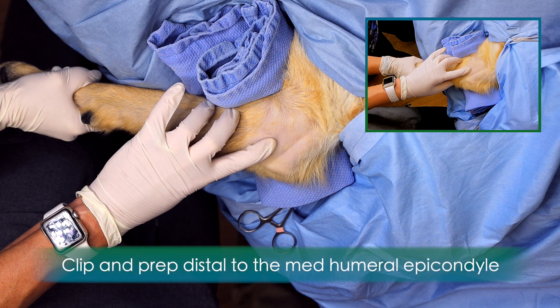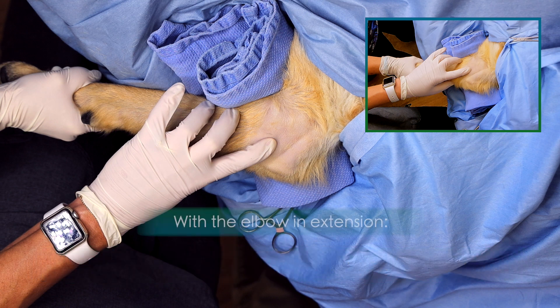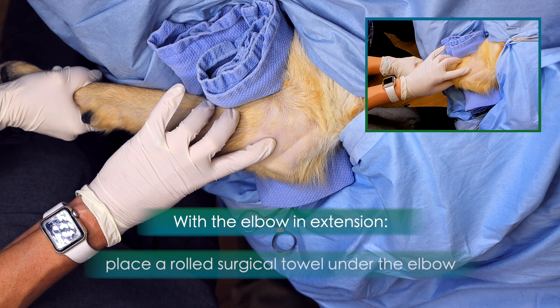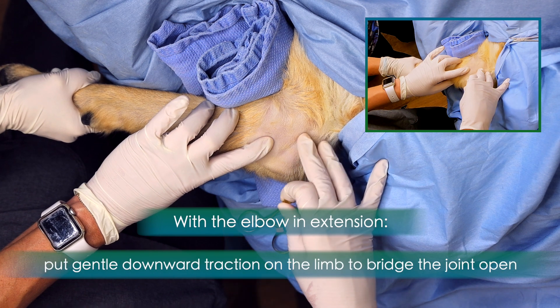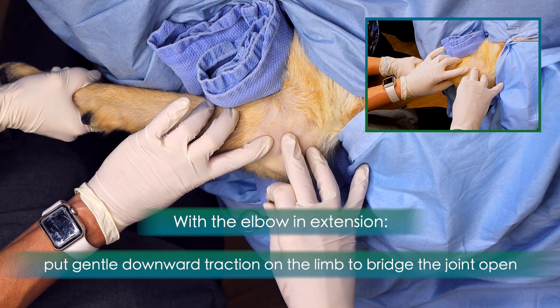The joint should be clipped and aseptically prepared for injection, distal and caudal to the medial humeral epicondyle. Begin with the elbow in extension. Have an assistant place a rolled surgical towel under the elbow and gently leverage the elbow open over the towel.